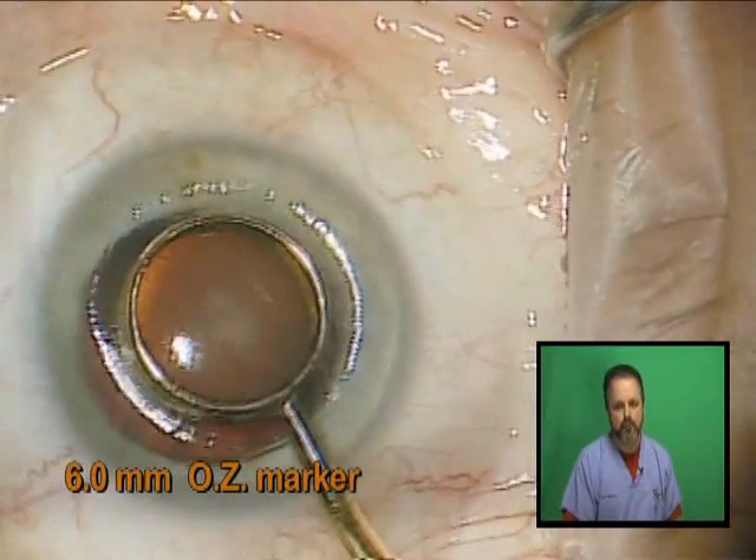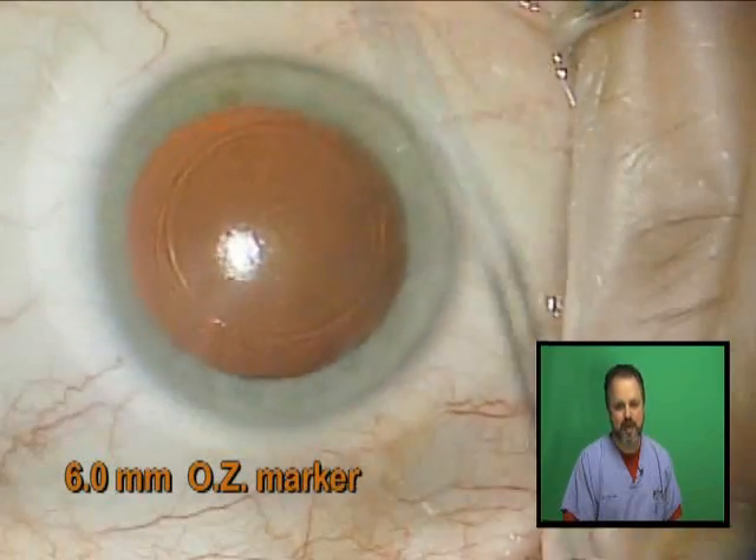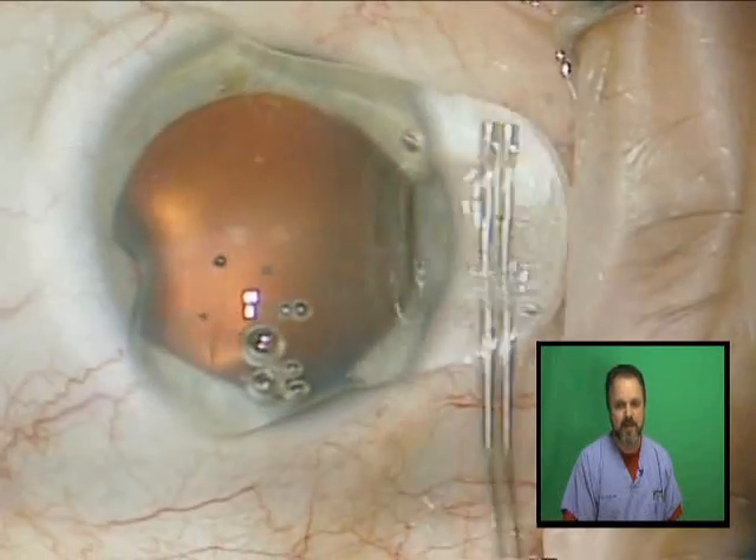To begin with, I like to mark the dry cornea with a 6 millimeter optical zone marker that I use as a template for my capsulorhexis.